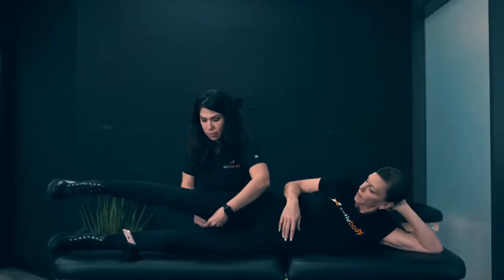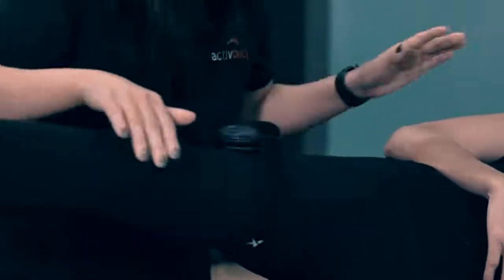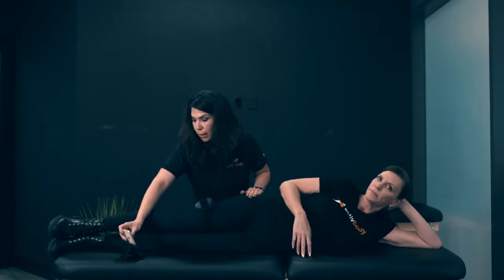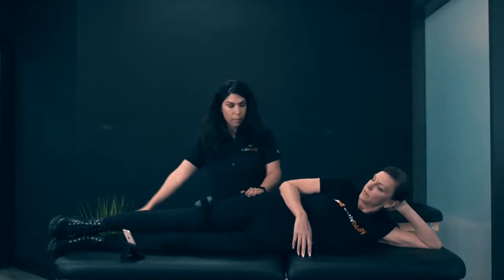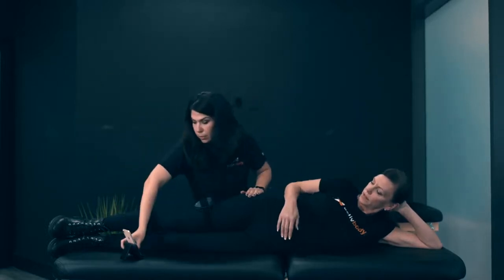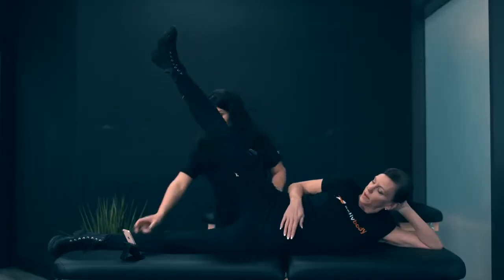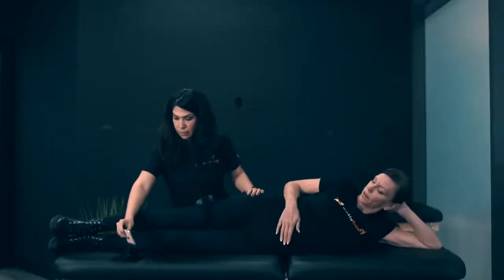I'm going to go ahead and strap this on. Go ahead and relax, bring your legs down. We're going to do range of motion — abduction of the right hip. I want you to lift your leg up as high as you can until you have any pain or discomfort, and then bring it back down. We're going to start the test. It's going to calibrate — go as high as you can and bring it down.